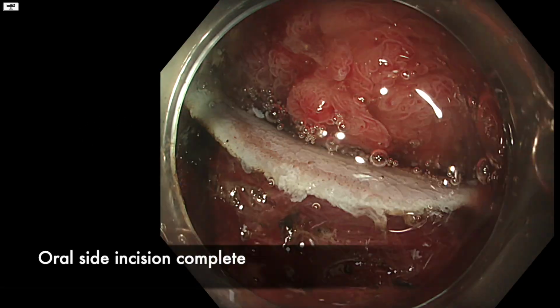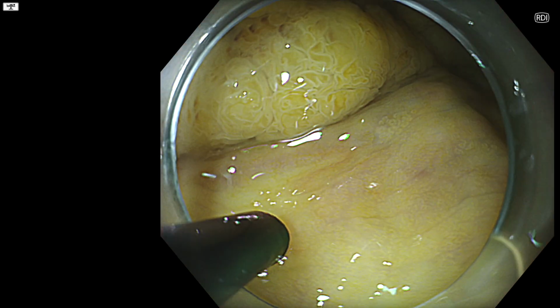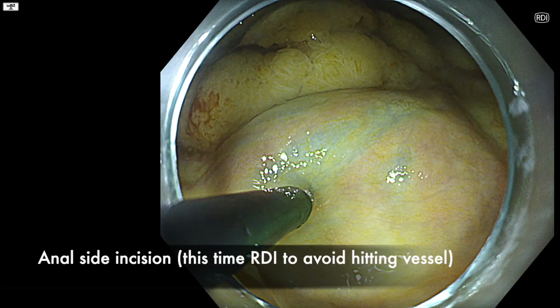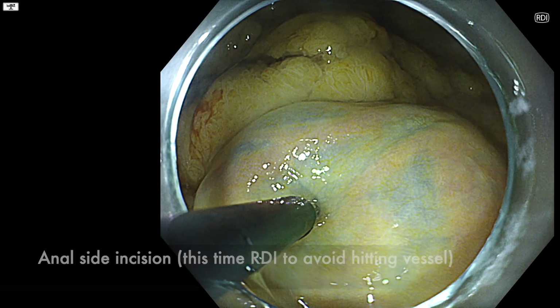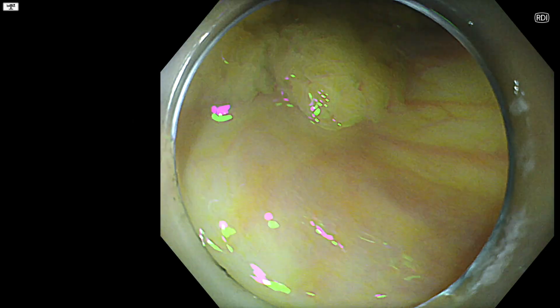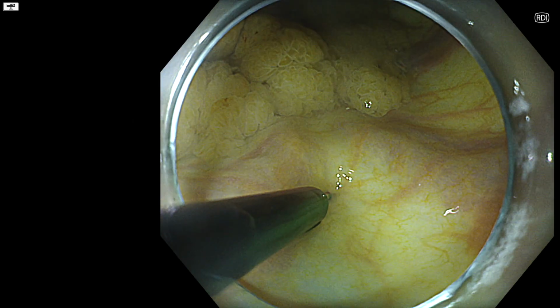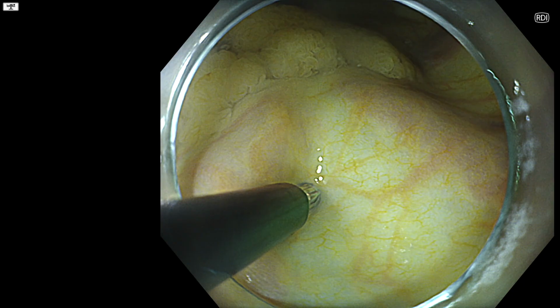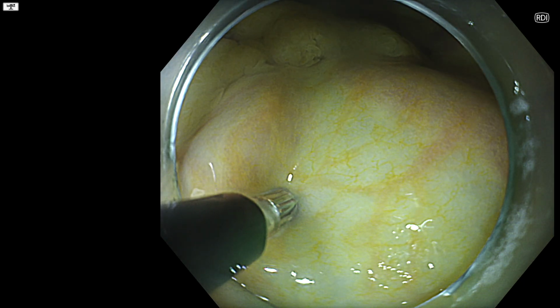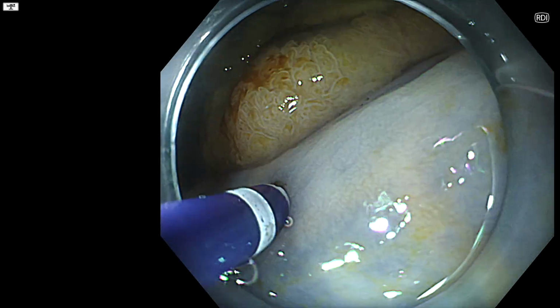Once the oral side incision is complete, we then move to forward vision, and a neat little trick during injection is to use RDI or NBI to avoid puncturing large submucosal vessels during injection. I have to thank my colleague Renzo for reminding me to switch it on, because honestly I forget about it most of the time. And I haven't really used RDI much during dissection, but the deeper submucosal vessels really show up very clearly, as you can see.